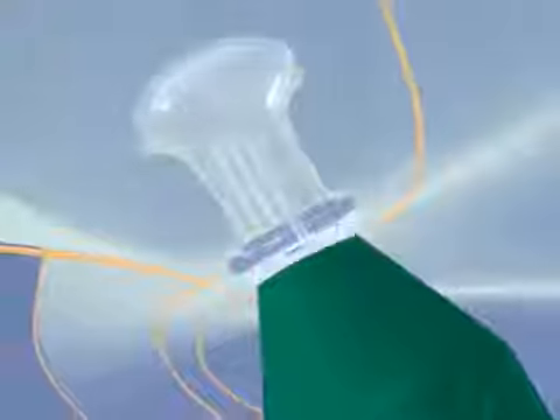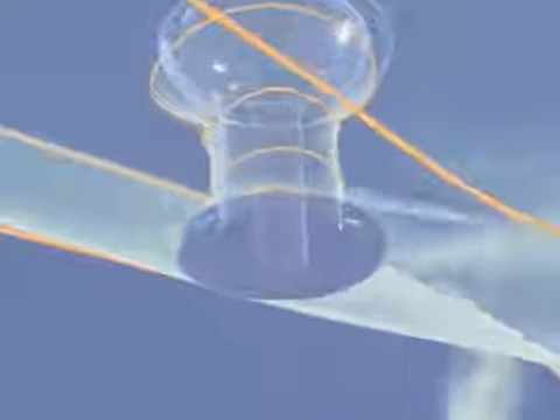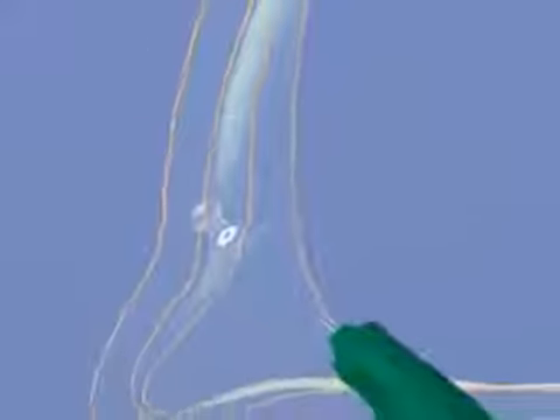A collar which sits on top of the eyelid and stops the plug from slipping into the punctum. Its thin profile reduces corneal irritation, matching the position of the punctum on the free edge of the eyelid. A body which links the collar and the bulb.